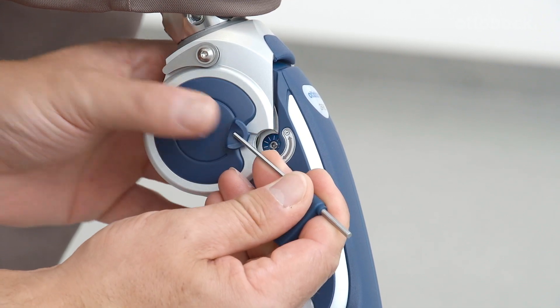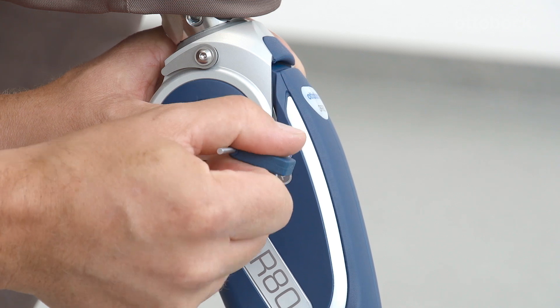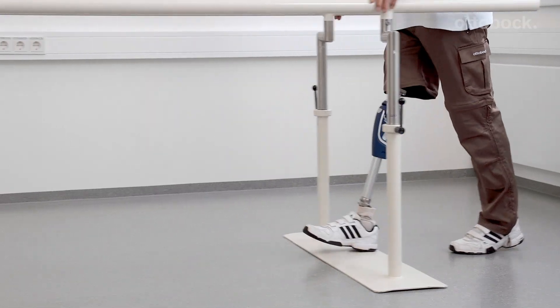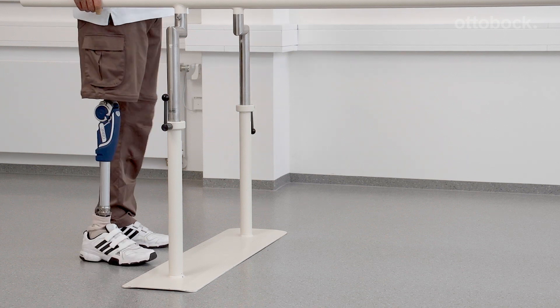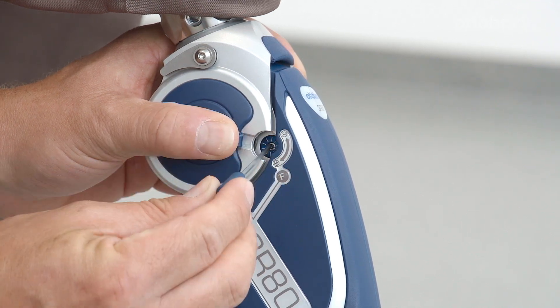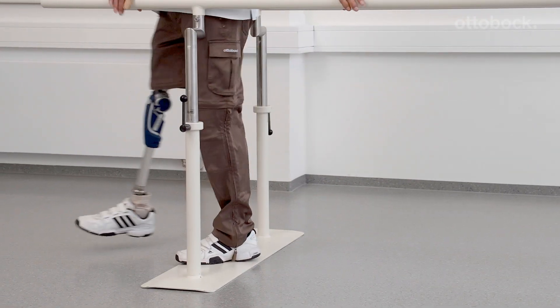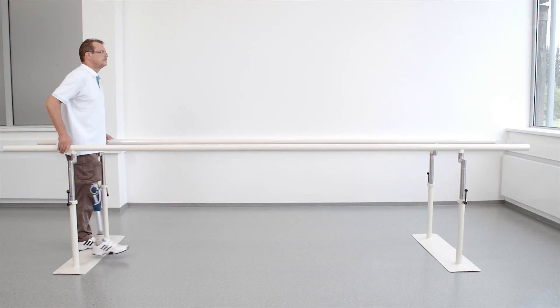The following video sequences will demonstrate how the knee joint reacts at the extreme settings of the swing phase damping. First, the knee joint is shown with the flexion damping set at the maximum. The flexion damping is then shown at its minimum. At higher walking speeds, the user has to wait too long for the prosthesis to reach full extension at heel strike. In order to achieve an optimal setting, the flexion damping should be adjusted according to the user's needs.